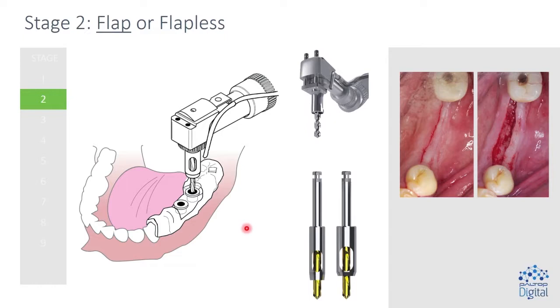Also, in most of these cases where you have an edentulous area, you're going to have some resorption of the buccal plate. So even though there's adequate bone — take a look at even Tidra — you're going to have some falling into that soft tissue. And so I can augment the soft tissue just by making an incision, because then I can push the soft tissue to the buccal.